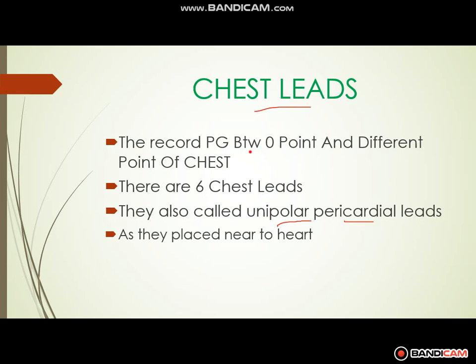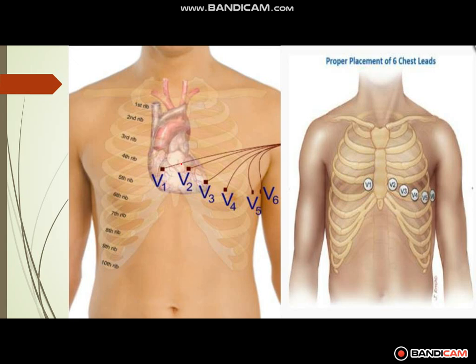If we connect these leads together like this, they will come together at a point which is the constant point, and these leads show or record the potential gradient between the extremity and this constant point, so they are unipolar leads.